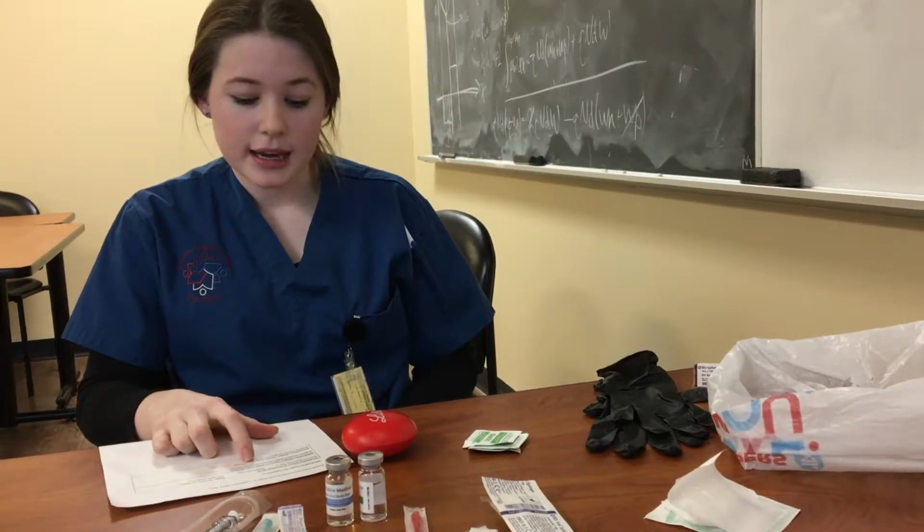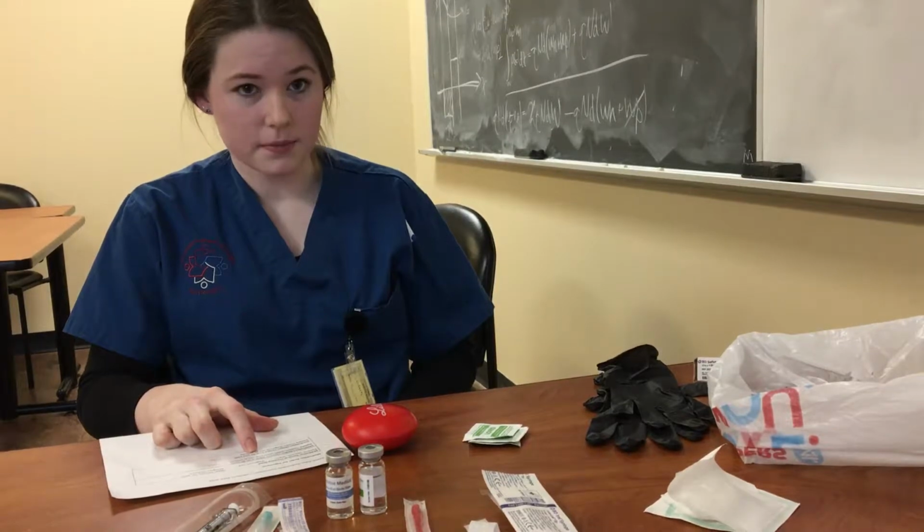Hi, so today we're going to be giving injections. I'm going to begin by looking at the MAR. So my patient is Mr. Mancini. He's been diagnosed with congestive heart failure. So the doctor has ordered heparin 5,000 units subcutaneously and Haldol 1 milligram IM.